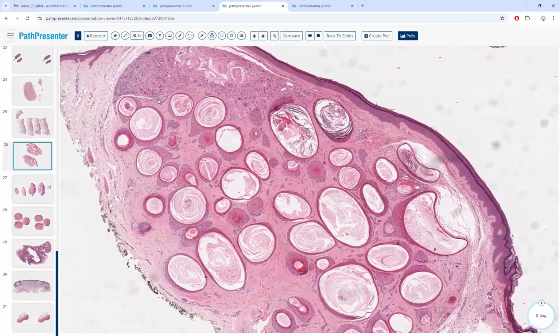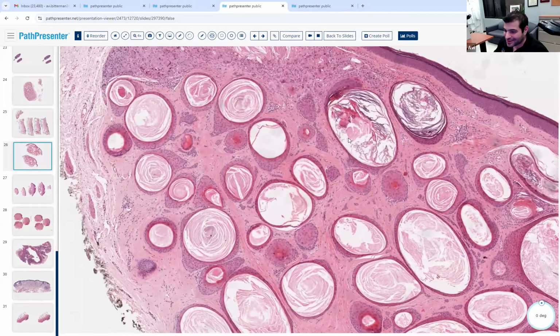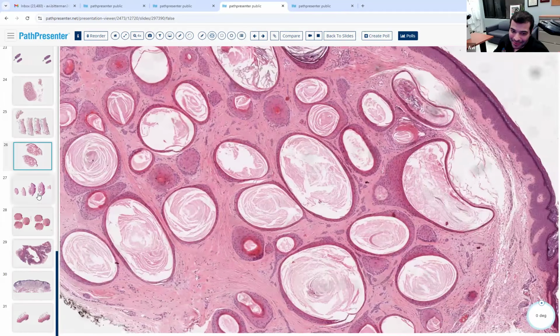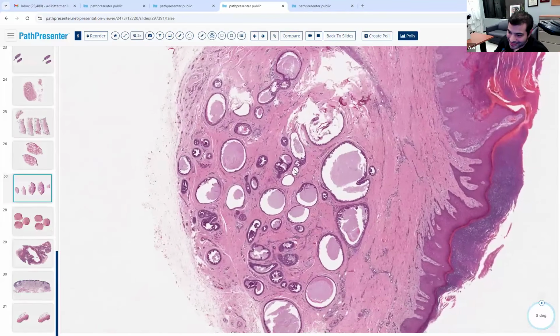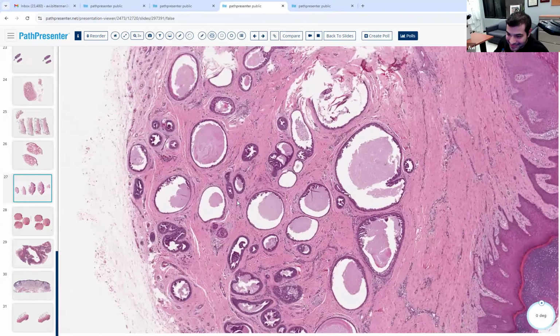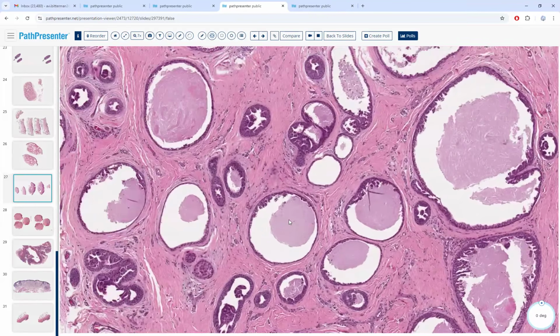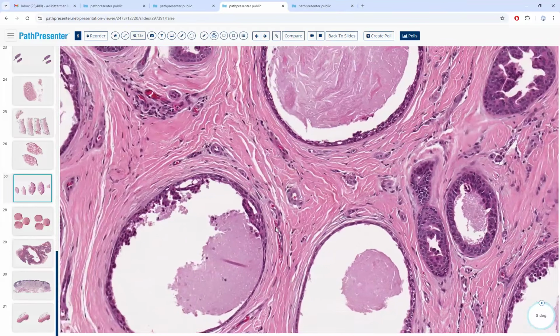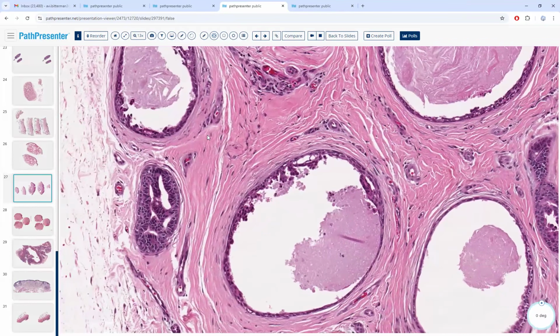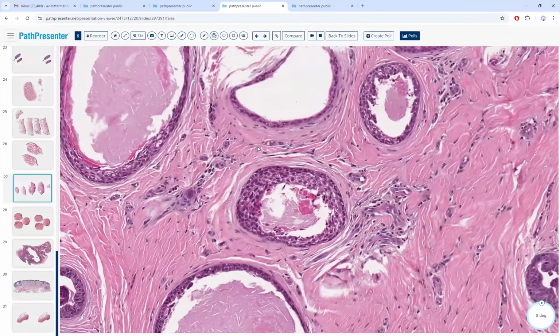Trichoadenoma. Okay, I think you guys know that pretty well. You get your toasted oats, trichoadenoma. Well, this looks similar to that, but what about this one? I think this is papillary adenoma versus tubular. They're basically the same thing. But I think this has a secretion and decapitation.